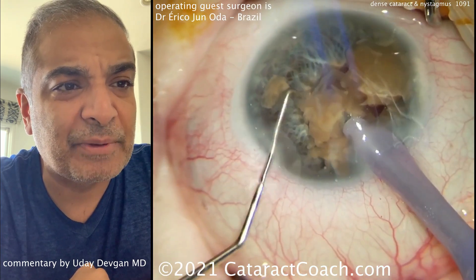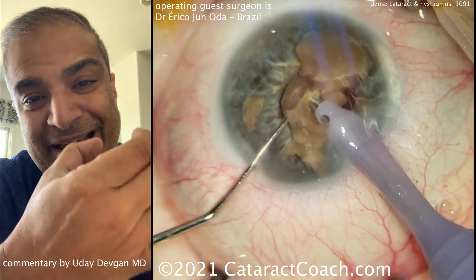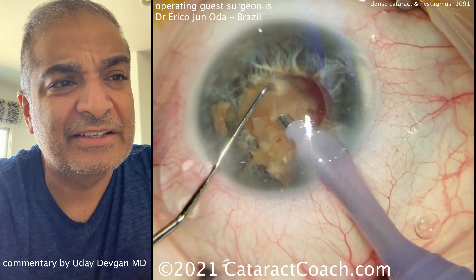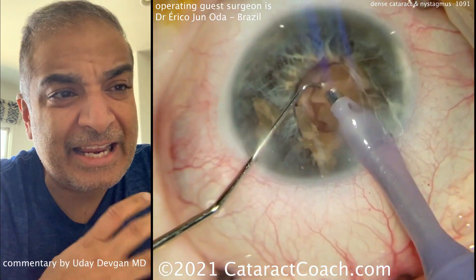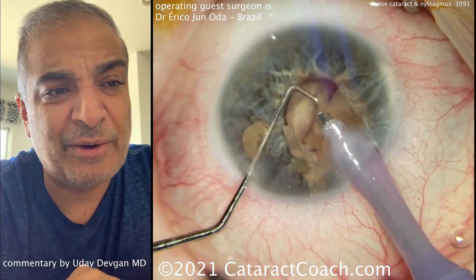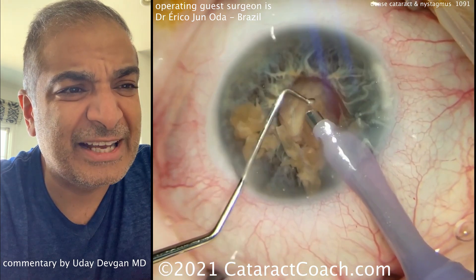Let's take out these last couple of pieces. Chop, chop, and chop. The pupil comes down now — that's going to make it a little more challenging, but that's okay. He's going to take his time, stay centrally, and be careful not to aspirate or catch any of the iris in the phaco port. The pieces go down real nice and easy.